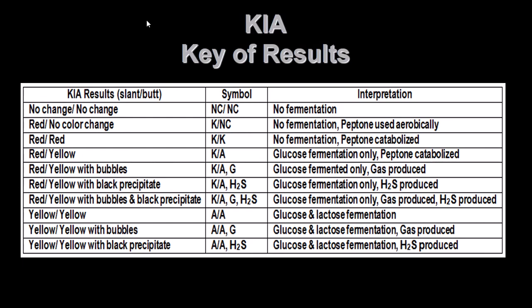In the biochemical tests that we use in the lab, a very important tube is the TSI, or the triple sugar iron. It contains the sugar glucose, and then we have lactose or sucrose as well. So you have to know whether it's a lactose fermenter or other sugar fermenter, whether it's a glucose fermenter, or whether it can utilize the peptone and change that into an alkaline.